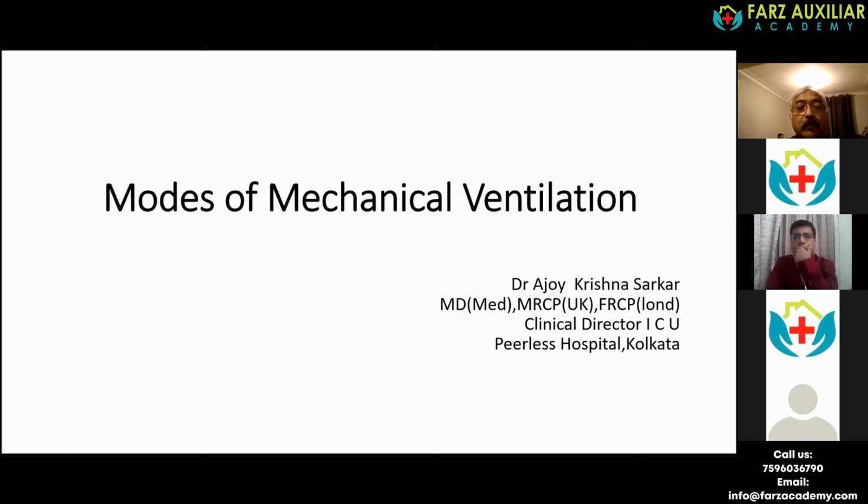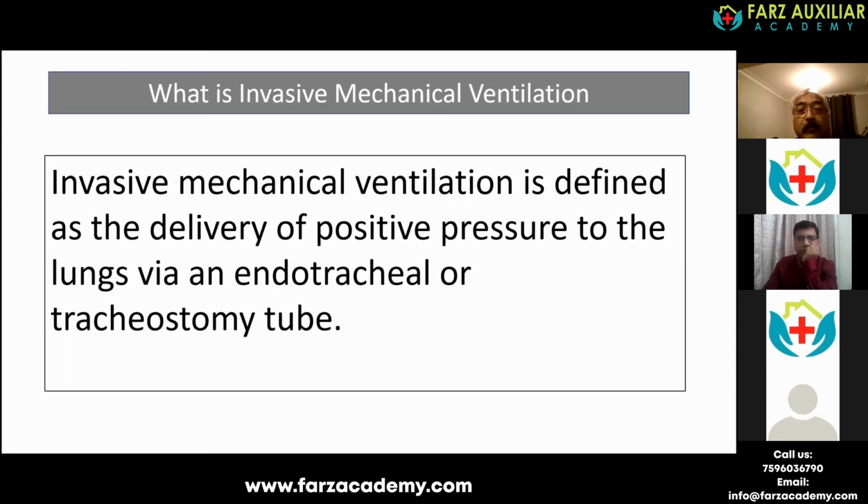I'm going to talk on basics. You have given me basics of modes of mechanical ventilation, basic modes, but I have omitted that purposefully because it all depends on the ventilator you are using. There are many modes coming up with the new ventilators. Actually, whether they are advanced or not is yet to be proved with recent studies. So I'll go through all those modes quickly.